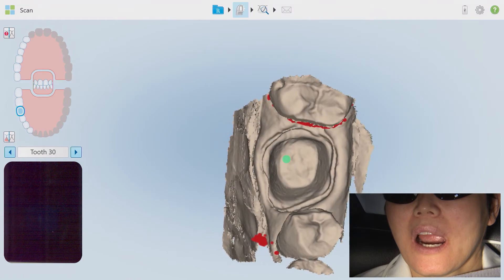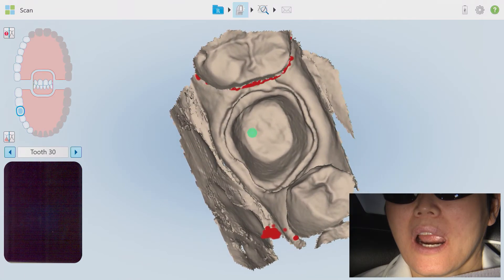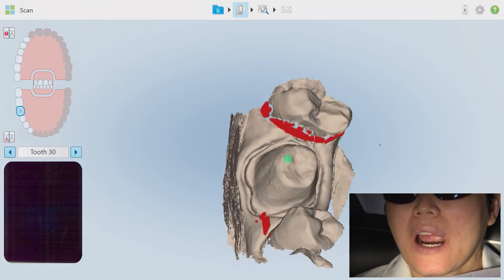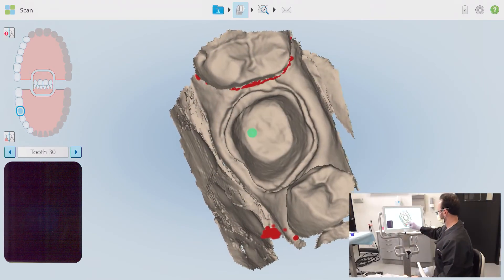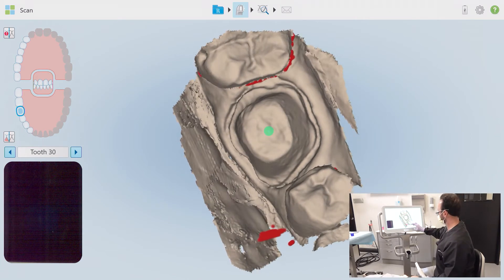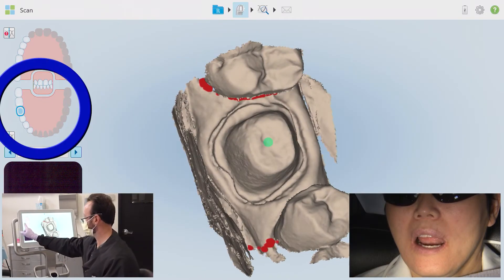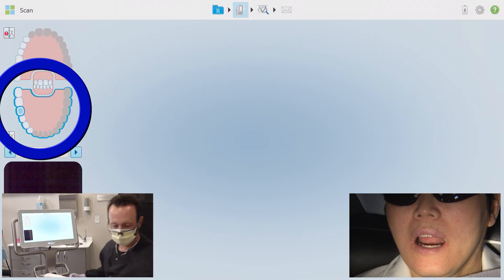As you take the preparation scan, a green dot will appear on the screen and attempt to locate the occlusal surface of the prep. If the dot does not automatically find the exact center of the occlusal or incisal surface, simply press and hold a finger on the dot until it becomes mobile and then relocate it to a more preferred position. Now that I'm satisfied with the preparation scan, I'm selecting the rest of the working arch and continuing.